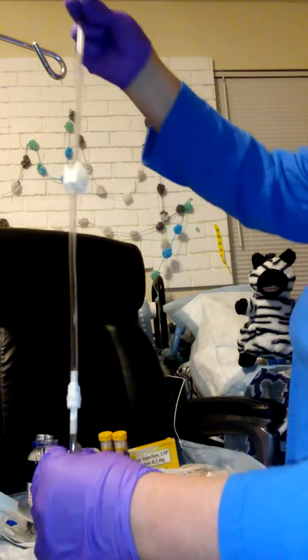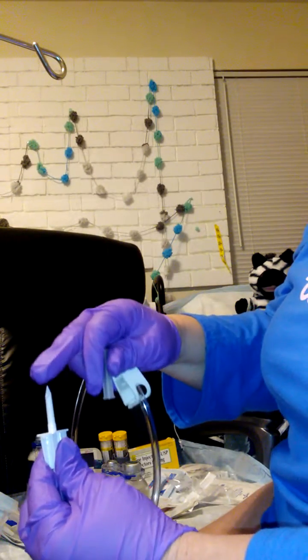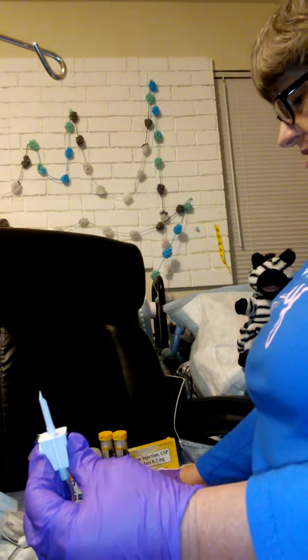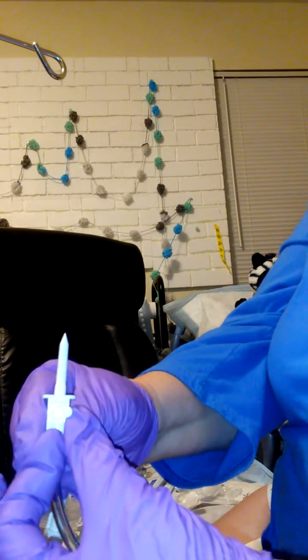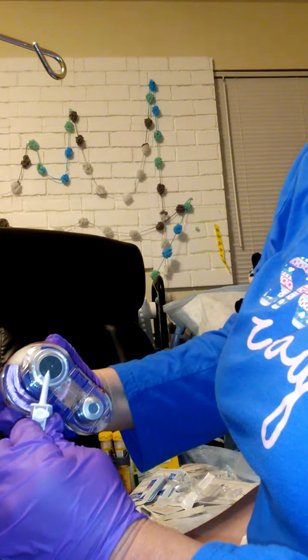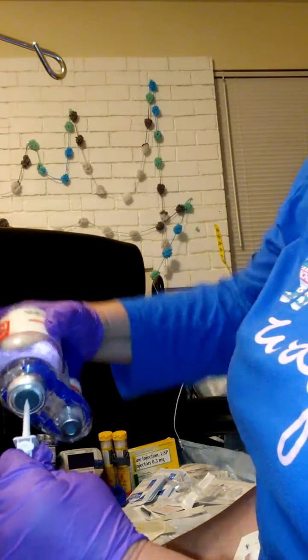Okay, all right, and so this part, like the blunt needle that I used earlier, is much larger and stronger, and is going to go into the top of this and draw this out. But before we do that, I'm going to lock this little clamp, and this little door here is closed. I call it a door or a window. It's closed. So we're going to go ahead and flip this up and go right into that hole. Well, it's not a hole, but it's a dimple. It's got 3 dimples there. You go into the big one right here. You push down.